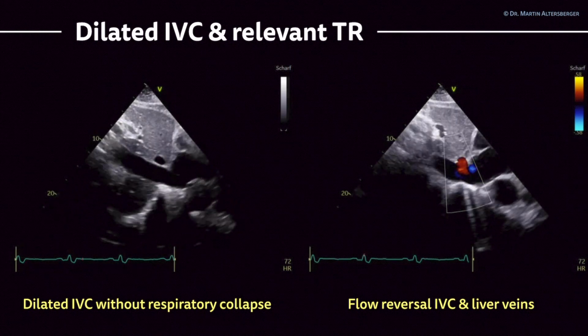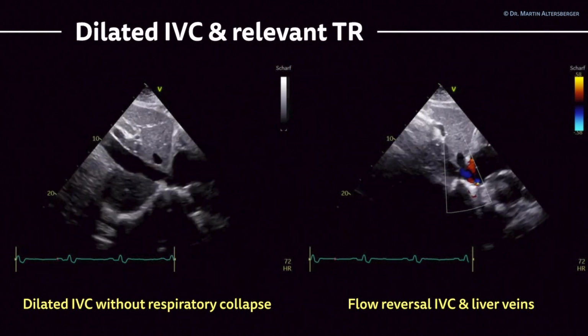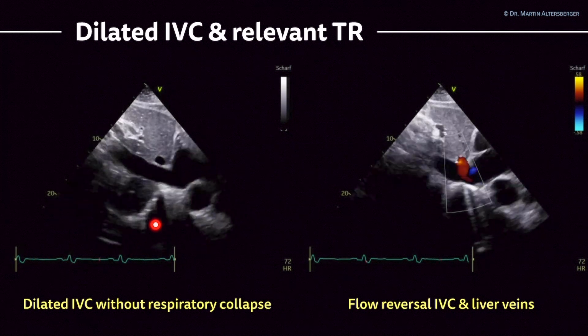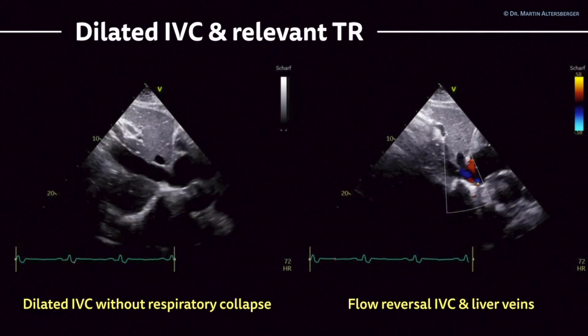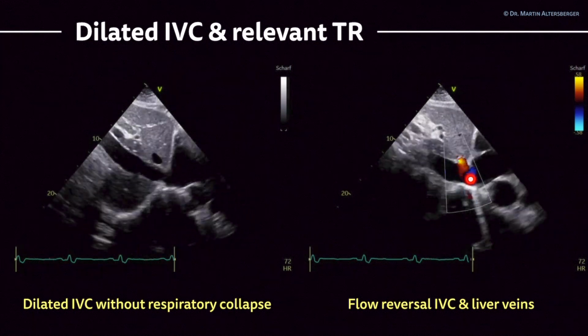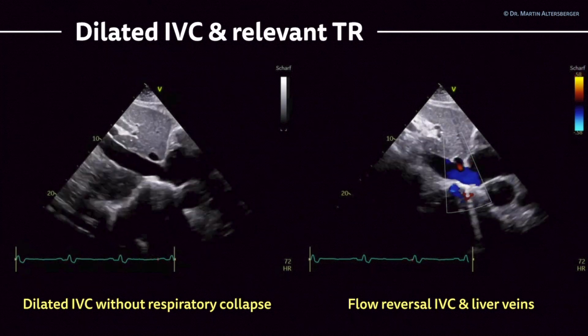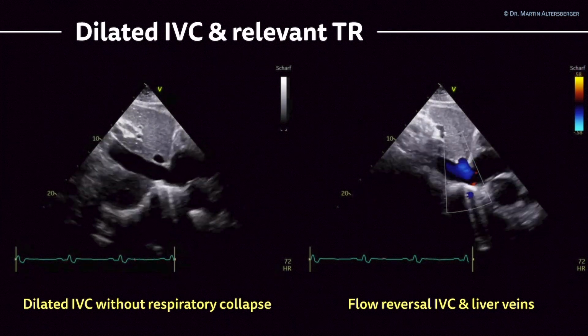In this case, we have a dilated inferior vena cava and there is practically no collapsibility during respiration. So this is not an intubated patient. This shows hypervolemia. Also, if you take a look over here, there is pleural effusion present, and using color Doppler, you do see this change in red and blue color, even though there is a normal PRF optimized for echocardiography.